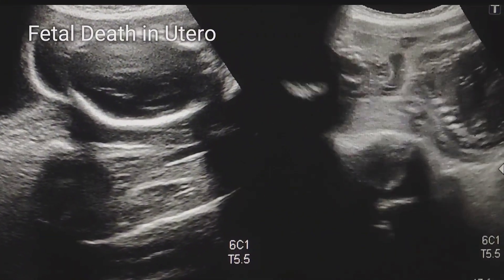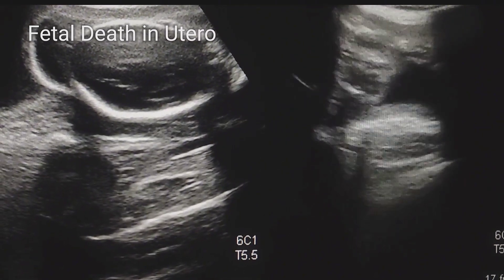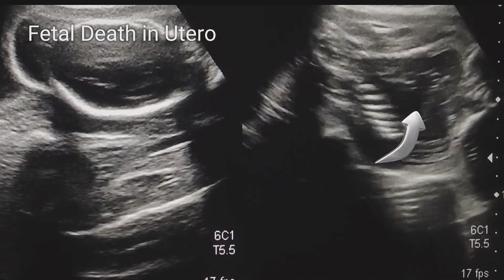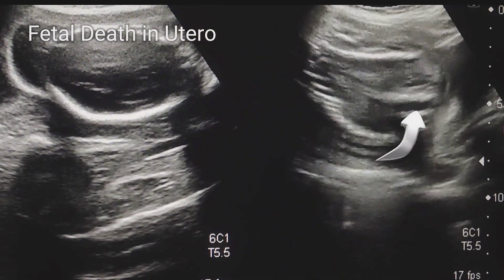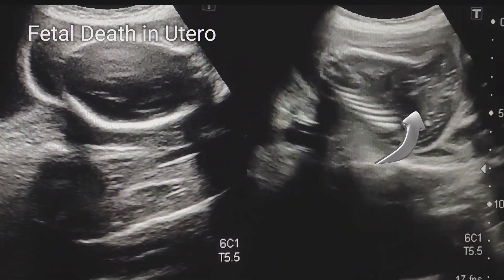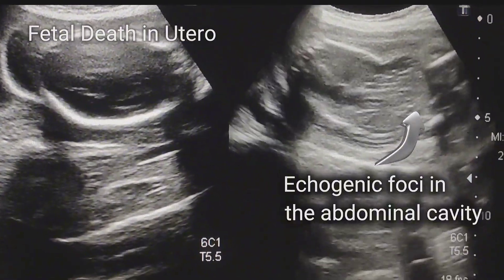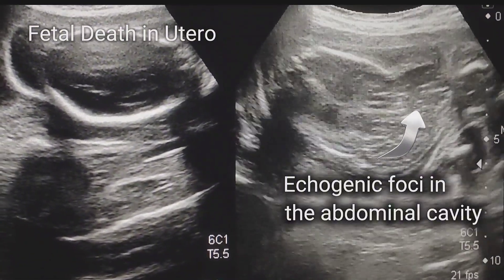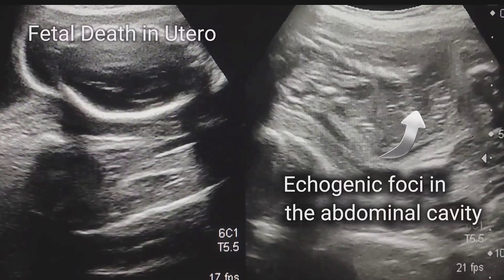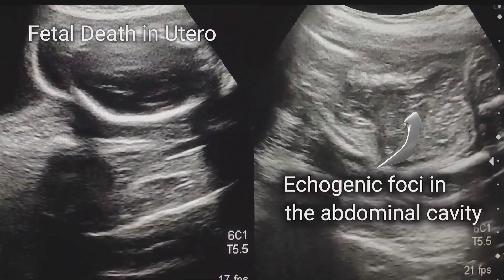In the abdominal region, we can see multiple echogenic foci. The thoracic region appears to be narrowed. These echogenic foci are seen throughout the abdominal region.